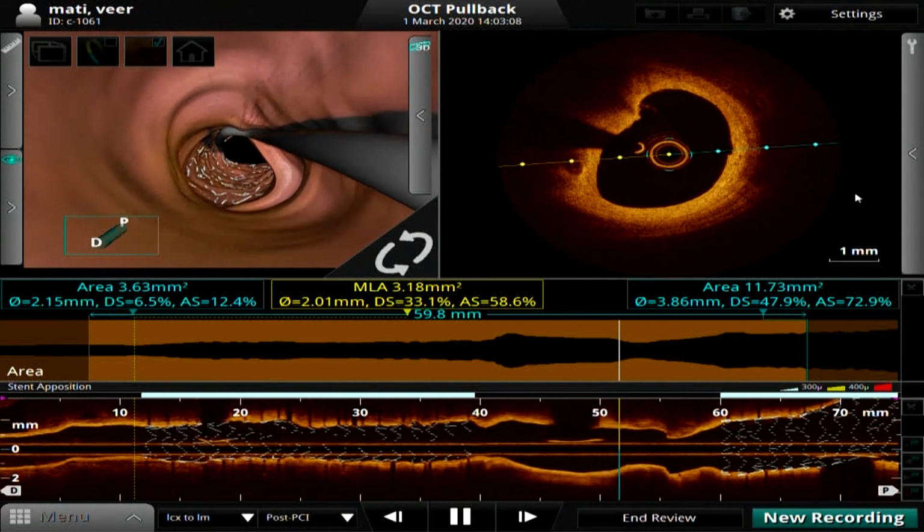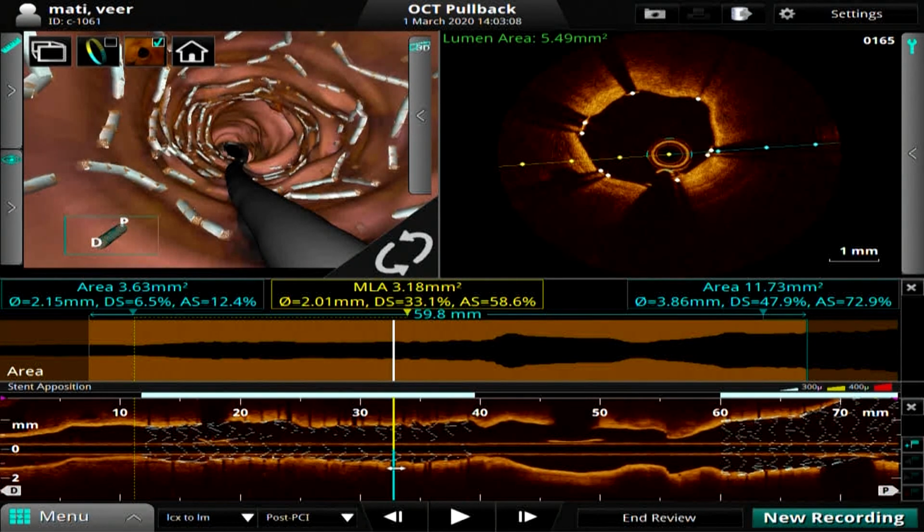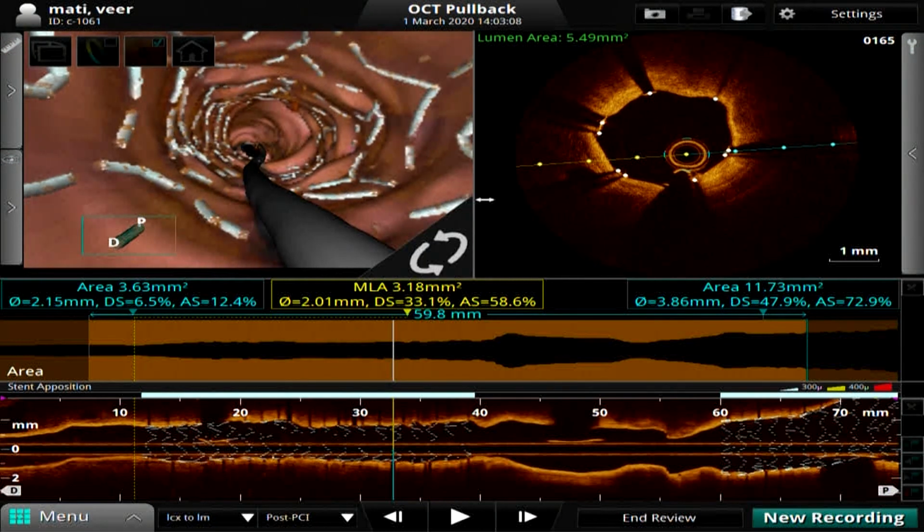Just stop. Any further comment? No, it looks great.